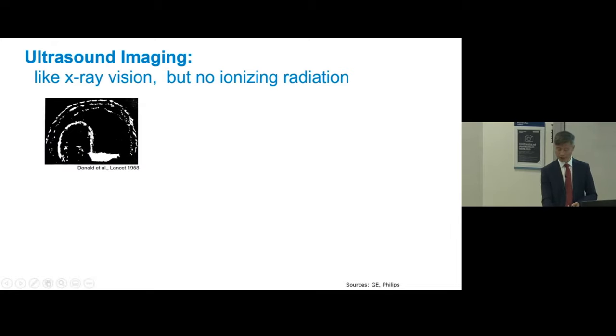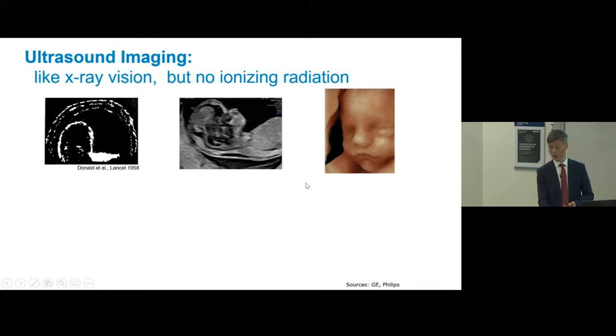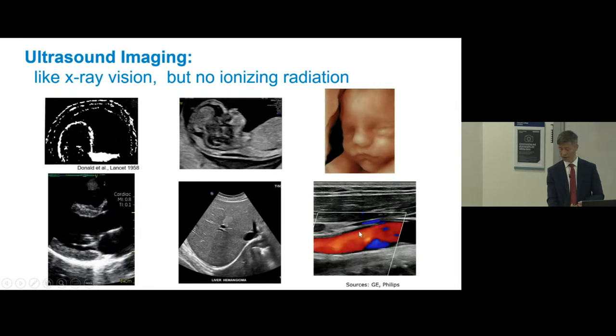I showed you this early image of the baby, and now you can see ultrasound has really come a long way. You can see excellent clinical images showing the details inside organs without opening them up, right? And also the dynamic information about the blood flow.